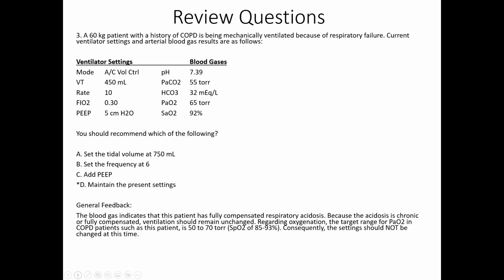It's close to that. So, even if they didn't give you the patient's either height or weight, and they did give you the tidal volume, in those cases, assert that the tidal volume is about 8 mLs per kg. It'll often give it to you, but not exclusively. So this is control, tidal volume of 450, respiratory rate is 10, FiO2 is 30%, and you can read PEEP is 5. Everybody puts their patients on PEEP of 5 to start with, except us.